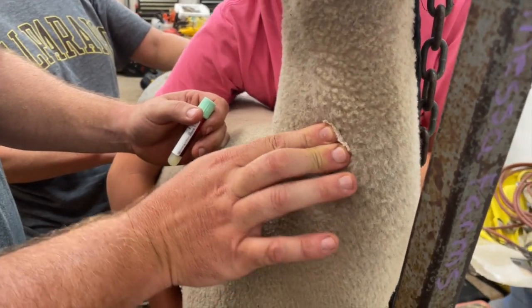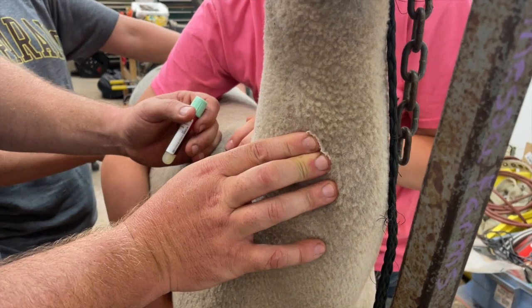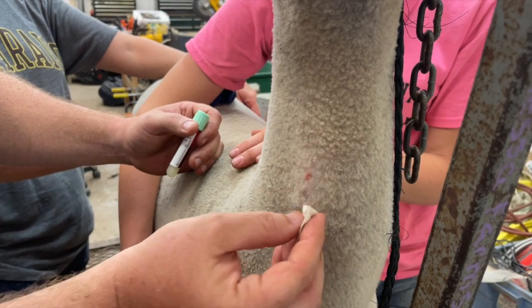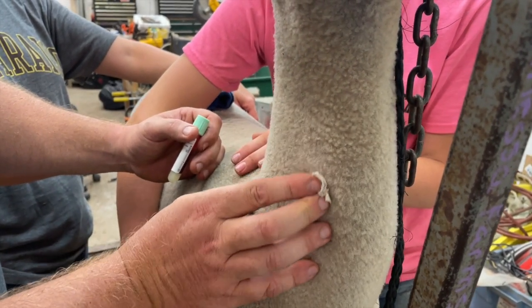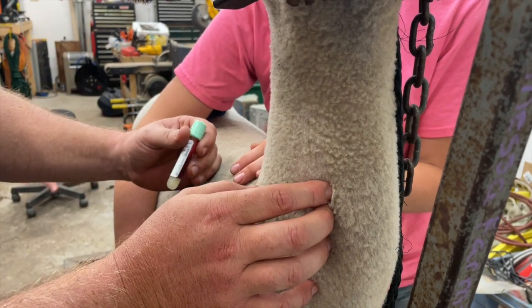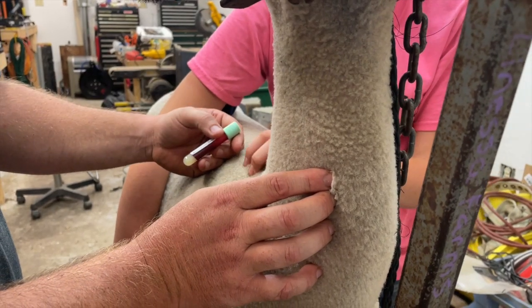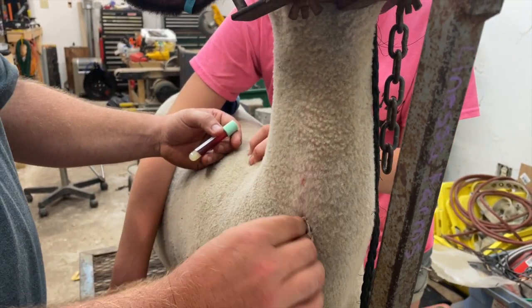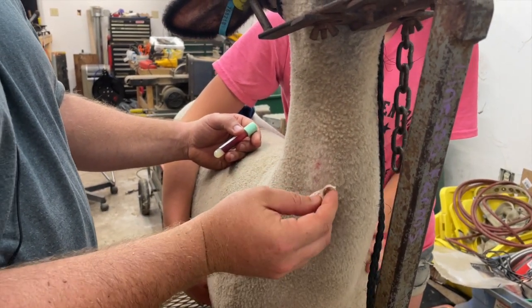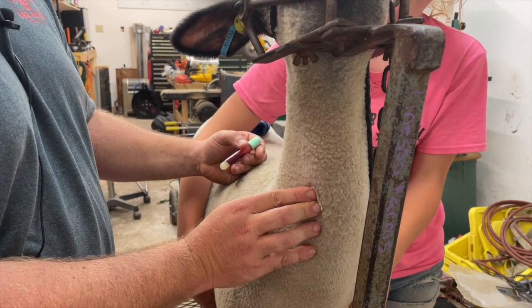It's going to take you a little bit of practice before you get good at it, but after you do about 10 or 12 of these, you'll be a real pro. Just feel for that vein and go for it. That is drawing sheep blood or goat blood 101. Hopefully you learned a lot and this gave you some insight into how to get this done on your small farm. I'm Tim from Lanessa Farms, specialty in heirloom livestock, and I look forward to seeing you again next time.